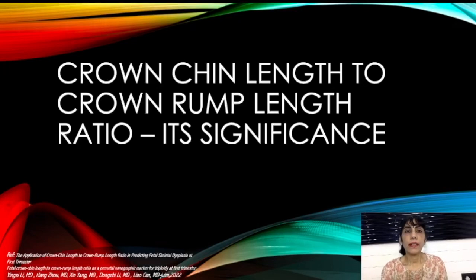Hello everyone. Today's topic is a relatively advanced one, which adds on to your NT-NB scan. Whenever we do the NT-NB scan, it is usually done between 11 to 14 weeks, or more precisely 11 weeks to 13 weeks, 6 days. We have been measuring nasal bone, nuchal translucency. Then we added ICT onto it. Then tricuspid regurgitation. Then ductus venosus flow.